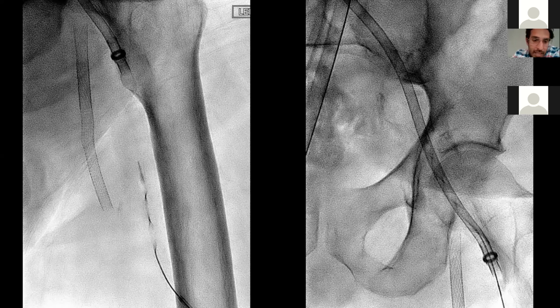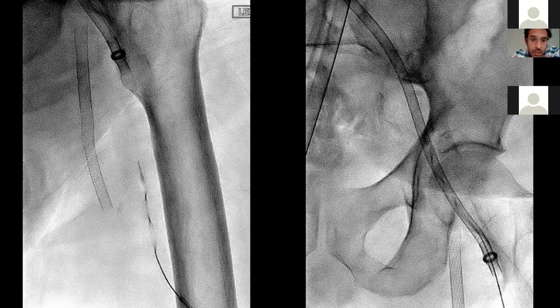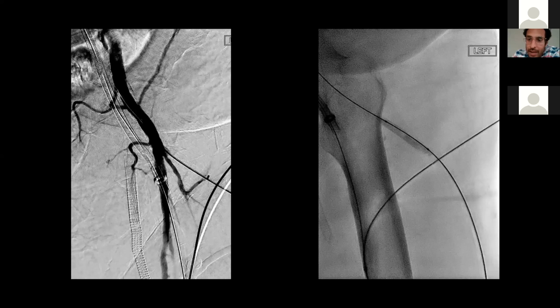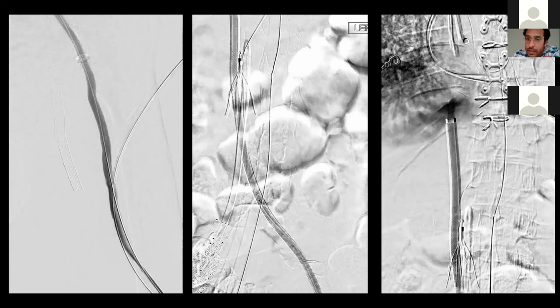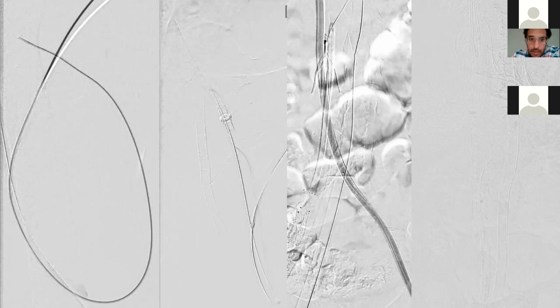I'm not really sure of the reasoning why it wasn't placed by, but again, this is just showing that you can use cleaner for this, and we used the cleaner all the way up through that. Angioplasty, pulled the plug, and you can see that this hero graft goes all the way to the right atrium. So this is probably the world's longest hero in existence, because it's probably not cut, is my guess. And then here's just the post showing the whole thing open.